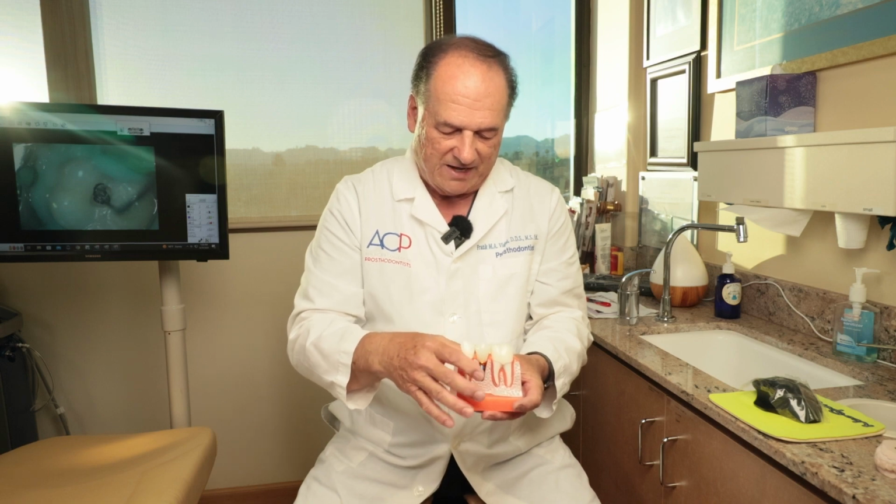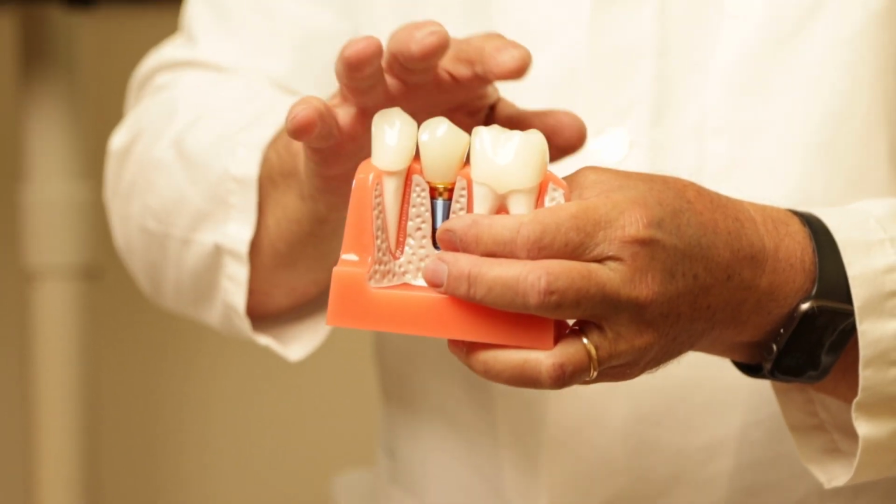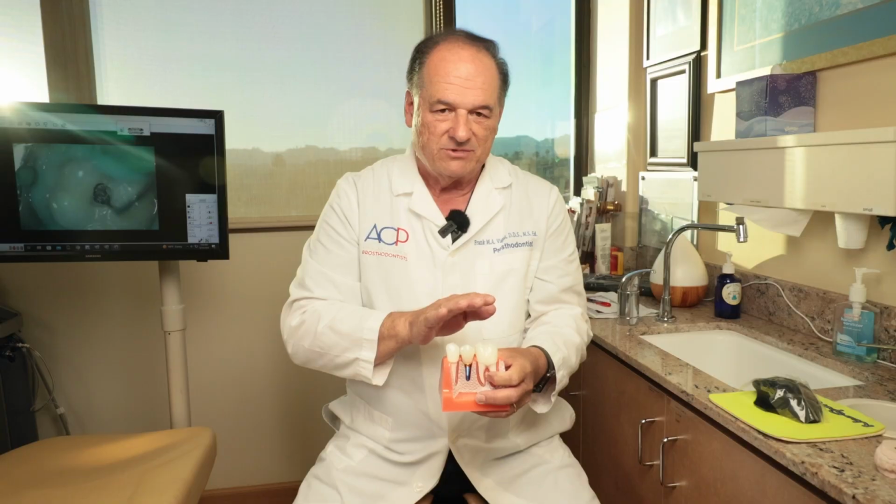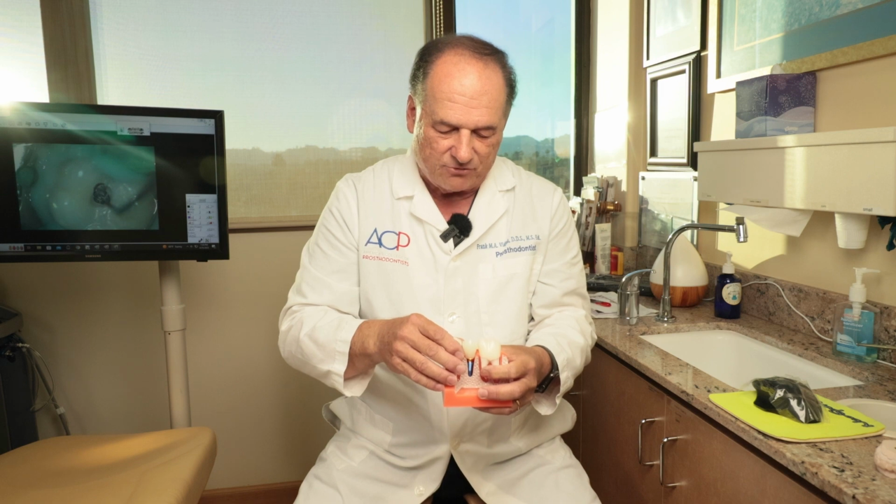Where's the advantage of that? Well, if these teeth never needed crowns, you leave them alone. If they needed crowns, well, why not put a bridge?